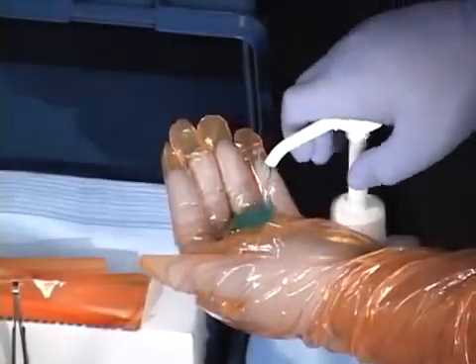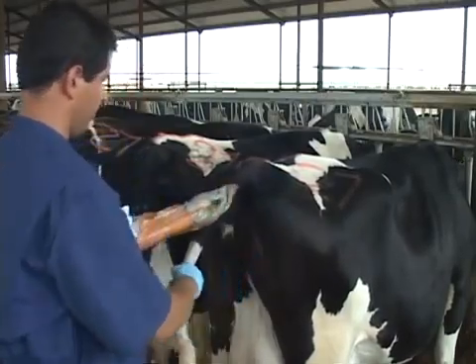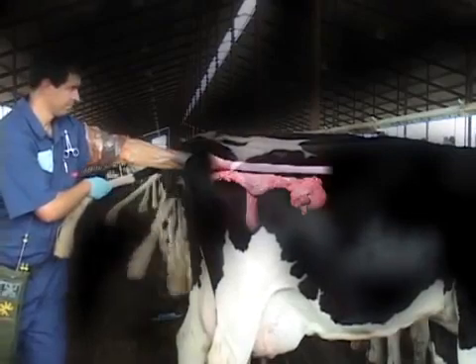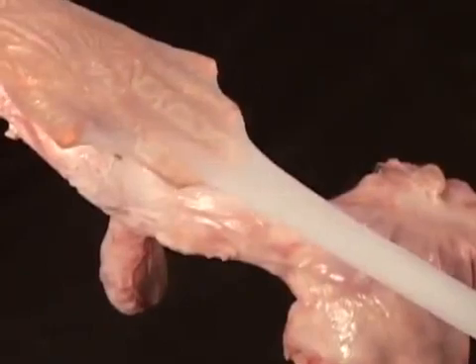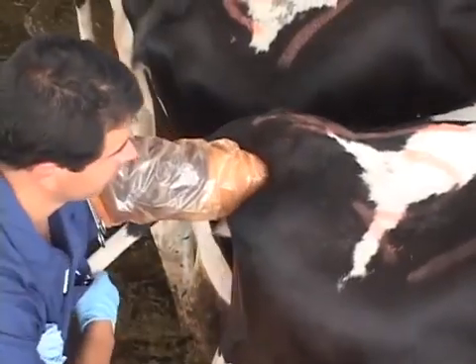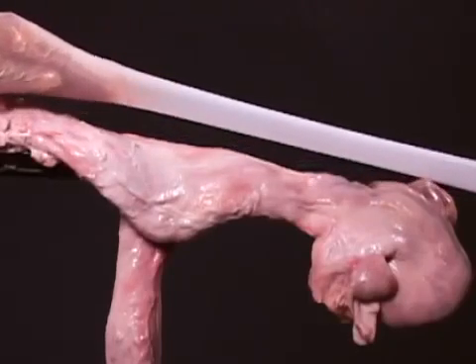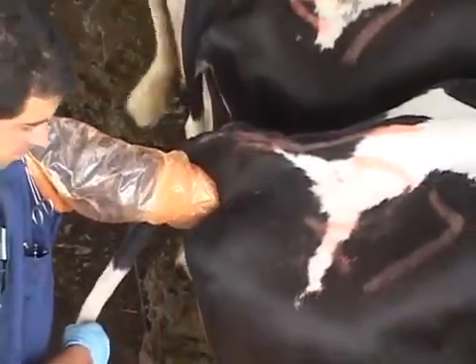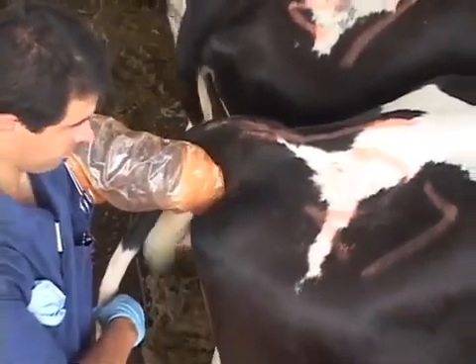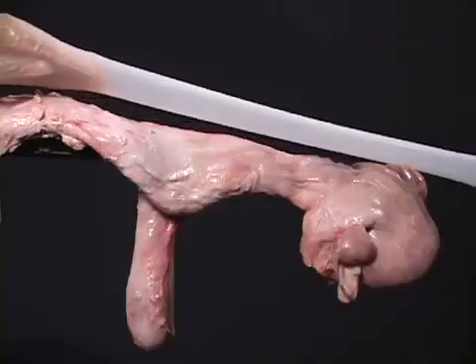Put on a shoulder-length disposable plastic glove, lubricate it, and stand sideways behind the cow. Form a cone with your fingers and gently insert the hand through the anal opening. Once the hand is fully in the rectum, open fingers from the cone position and remove fecal matter if needed by cupping the hand and pulling it out without taking your hand out. Avoid excessive motion of your arm because it causes air to rush into the rectum, resulting in a ballooning effect which will not allow you to grasp the cervix.